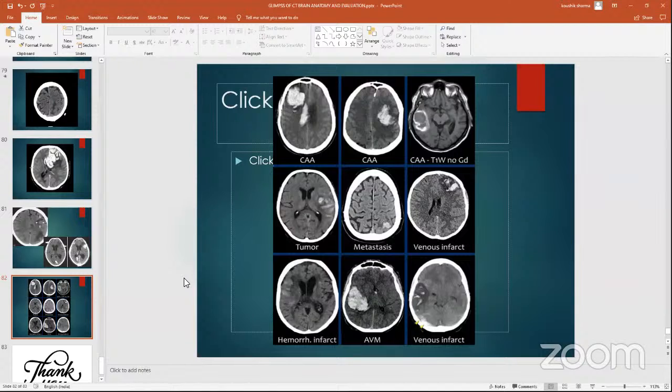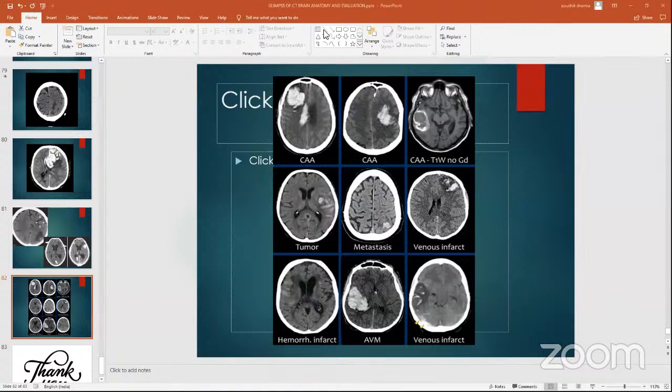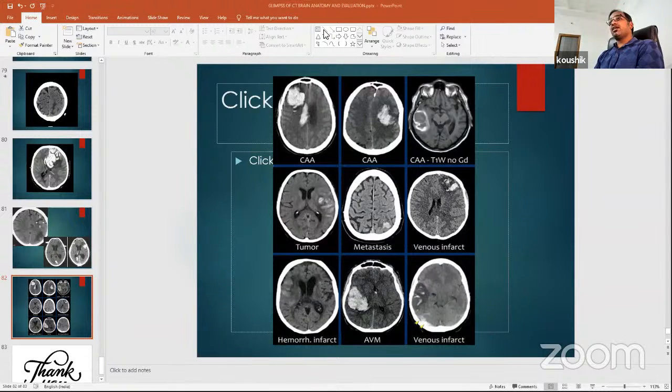One of the doctors wants to know about screening MRI for brainstem. What can we make out compared to the full MRI study? How do we make out from a screening MRI compared to the full study? Actually, in any MRI, we usually cover the brainstem.